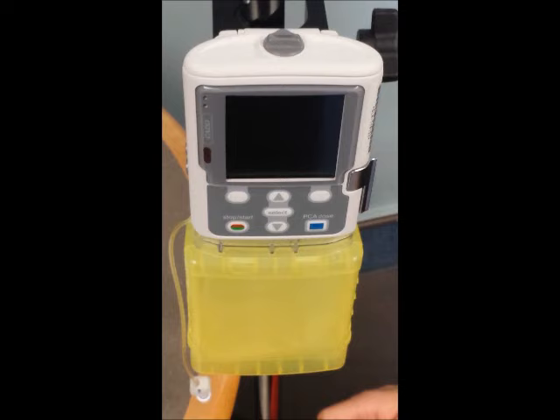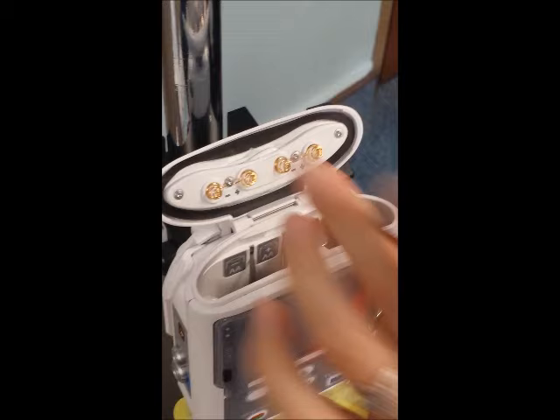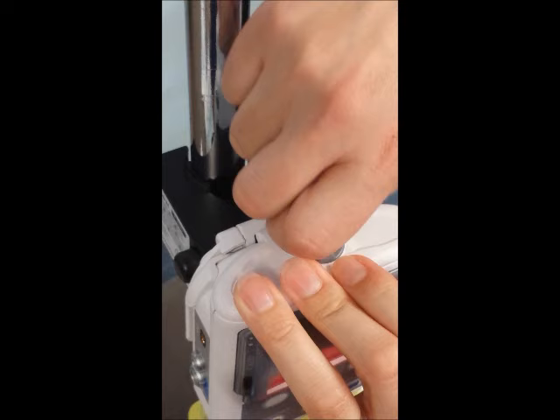What the nurses are also responsible for is changing the battery. This is located at the top of the pump. You turn the gray knob a quarter turn to the left. It takes AA batteries — these just lift out. There's also an indicator to tell you which direction the batteries go. Slide in the new batteries and turn the knob at the top.